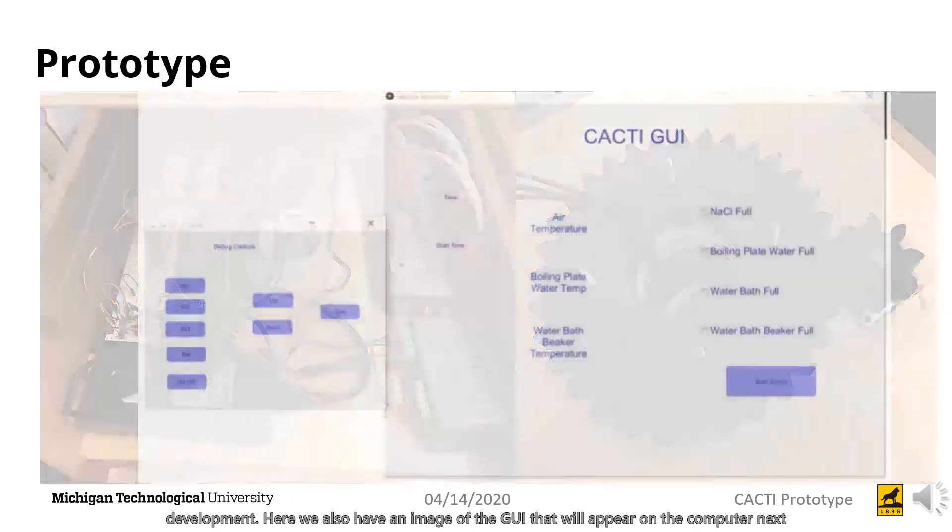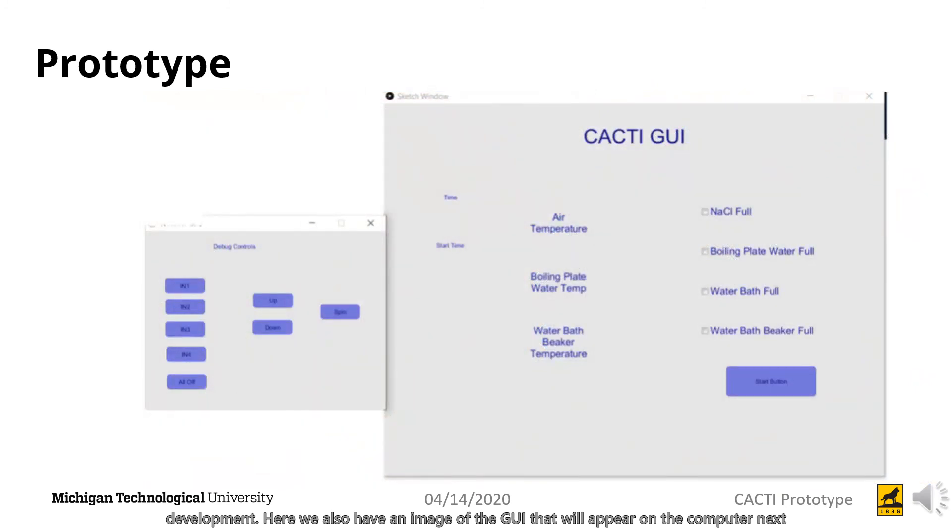Here we also have an image of the GUI that will appear on the computer next to the machine, which includes a checklist of fail-safes to make sure that the technician running the test has all of the components filled with the appropriate solution. There is also real-time presentation of the air temperature, boiling plate water temperature, and water bath beaker temperature, as well as times.